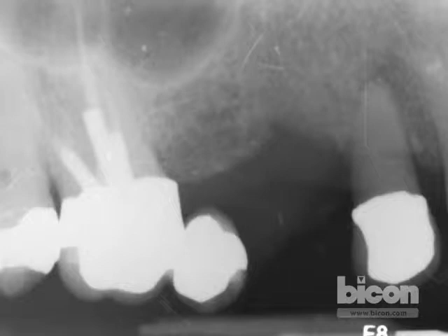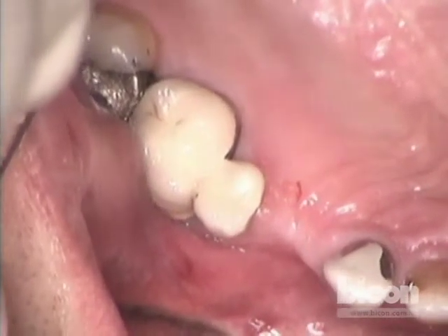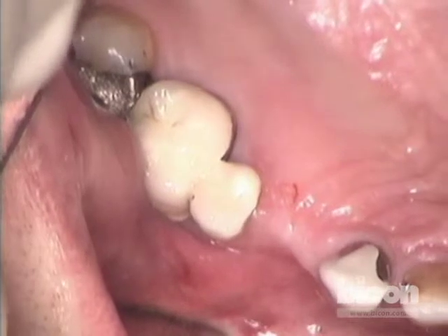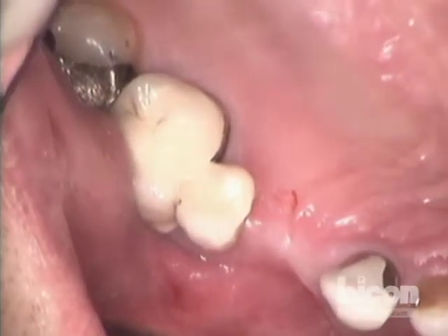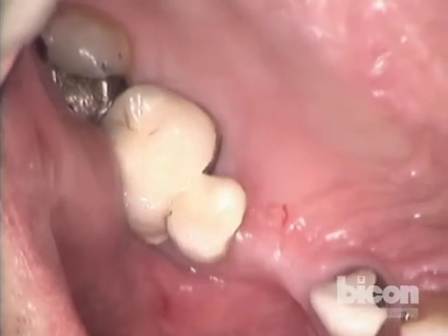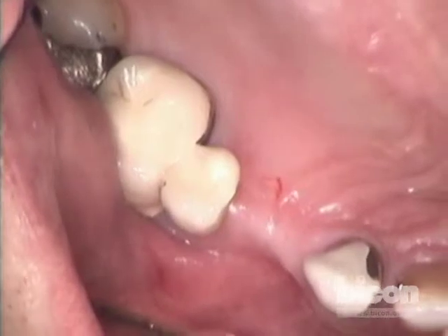Let's take a look at what we see clinically. So as you see, there's this depression between the bottom right-hand corner of your screen, which is the canine, and the center of your screen, which is the cantilever pontic. And there you see that the buccal plate has caved in. So we have that slight buccal defect.